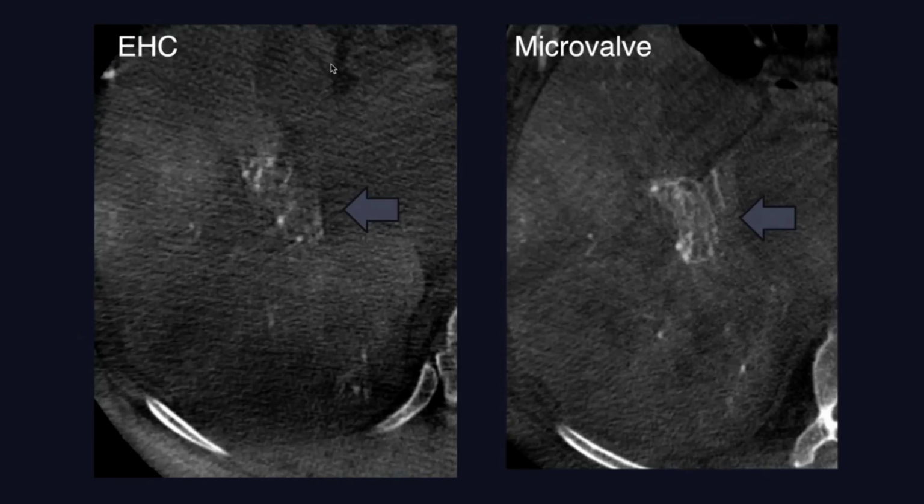Here you can see on the left, the end-hole catheter. And there are some arteries going to the tumor, but you really don't see that dense enhancement that you would hope to see if you were really going to get a significant amount of radioembolic material into the tumor. So at that moment, we swapped it out for a microvalve.